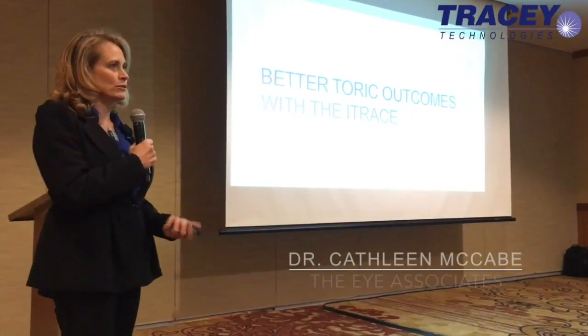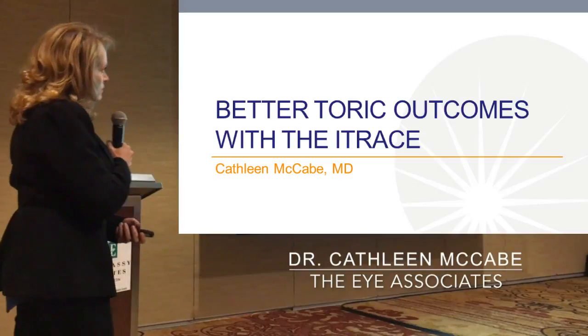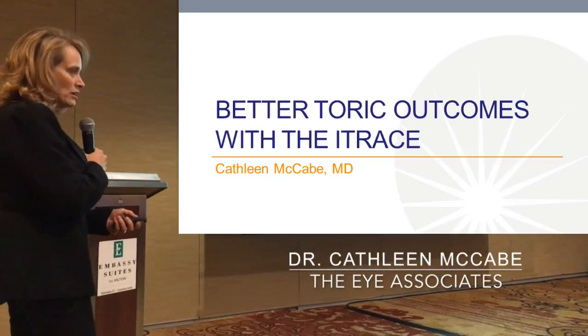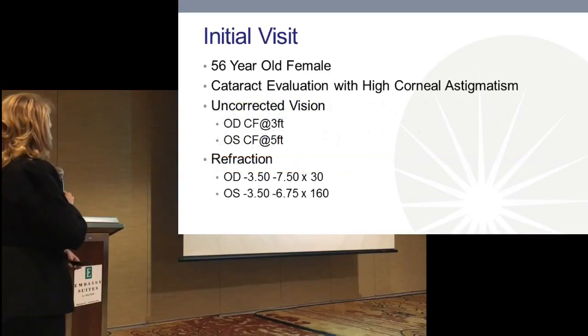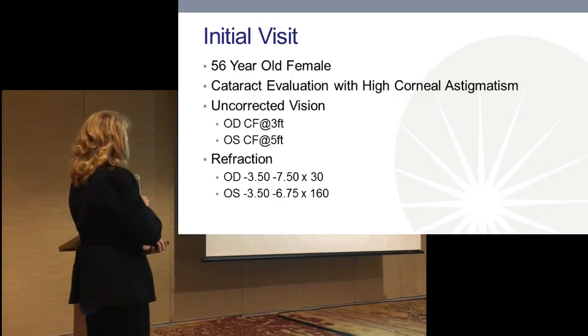So when Ray asked me if I would present a case, I just wanted to present a case where our iTrace was helpful to me. And I think that it gives you information you can't get any other way, and it's really exquisite.